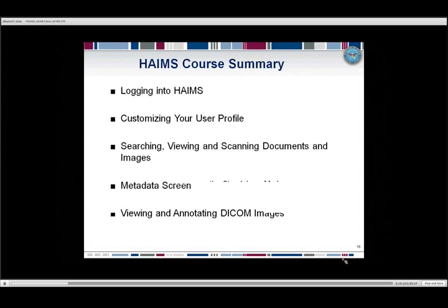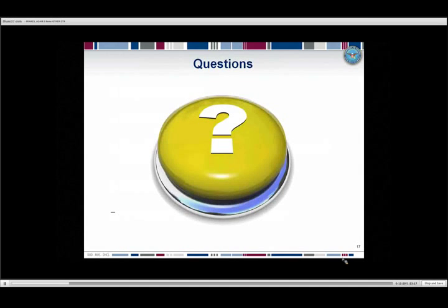So in summary, we're going to log into the account. You can customize your user profile. We're going to show you how to search, view, and scan documents. We'll talk a little bit more about metadata and how to view and acquire and annotate DICOM images. That's it for the slide presentation. Do I have any other questions?